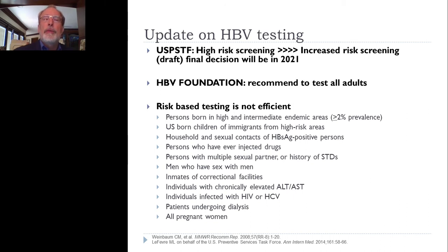Tests used to screen for hepatitis B, as indicated here, is this triple panel. Hepatitis B surface antigen indicates infection, linkage to care. Core antibody equals exposure. This is a very specific test with a false positive rate of only 2 per 1,000.